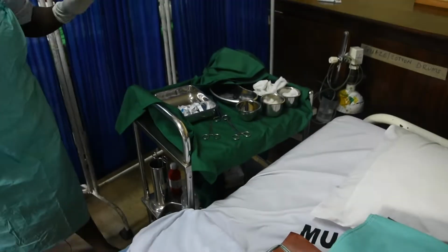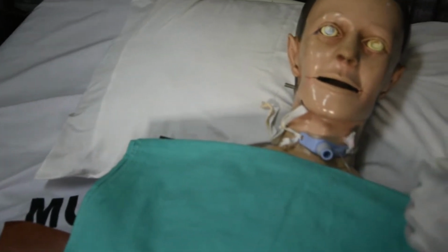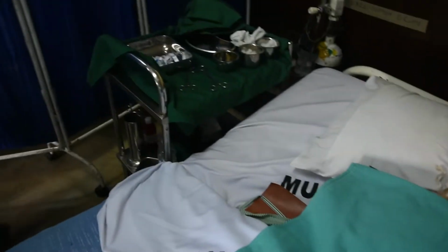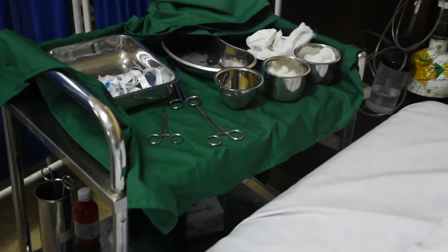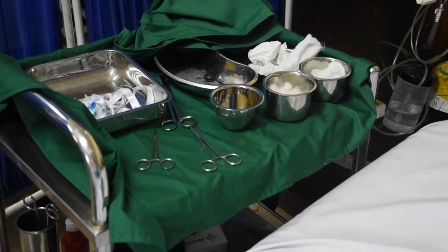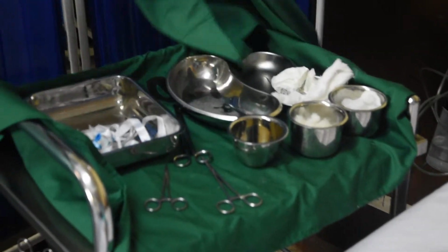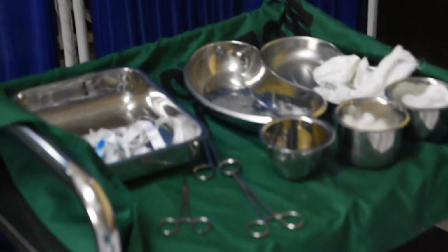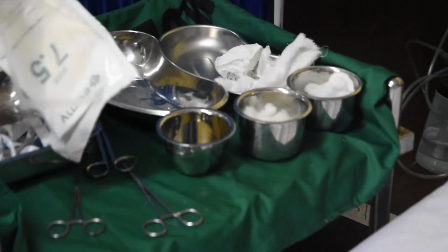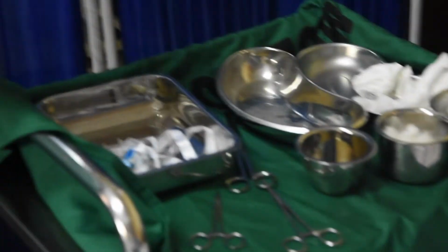So my gloves are already contaminated. I have to get a new pair of gloves.